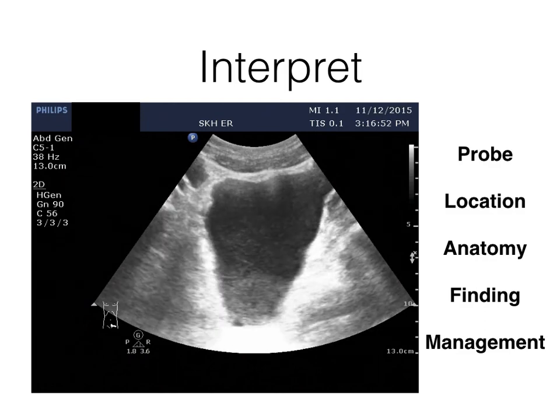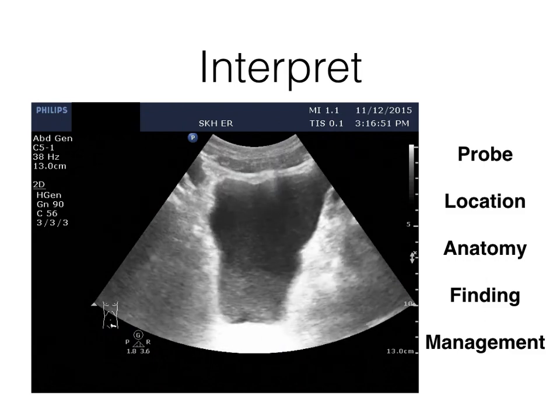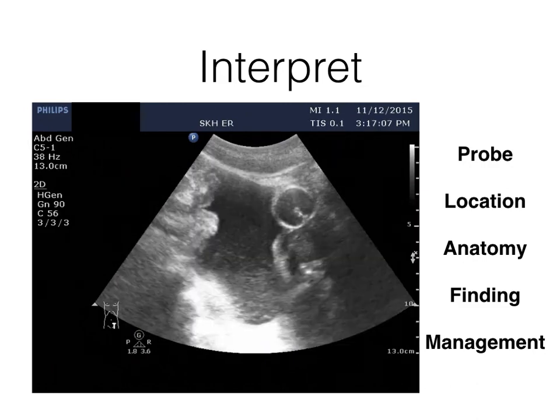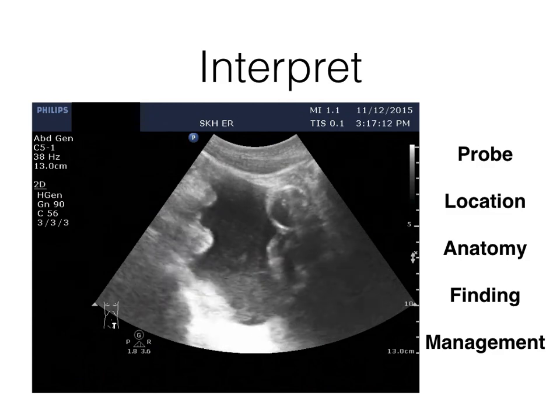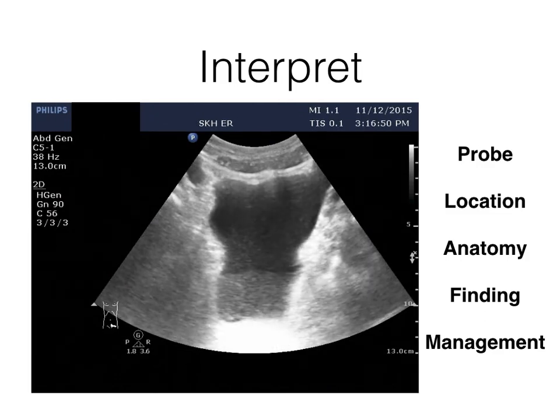This is bladder or ascites? Bladder. All of you think this is bladder. Okay. See? Is that bladder? The same. I just scanned here transversely to produce this image.